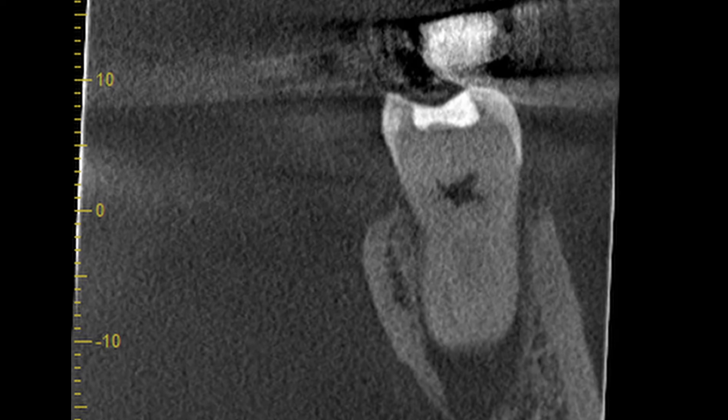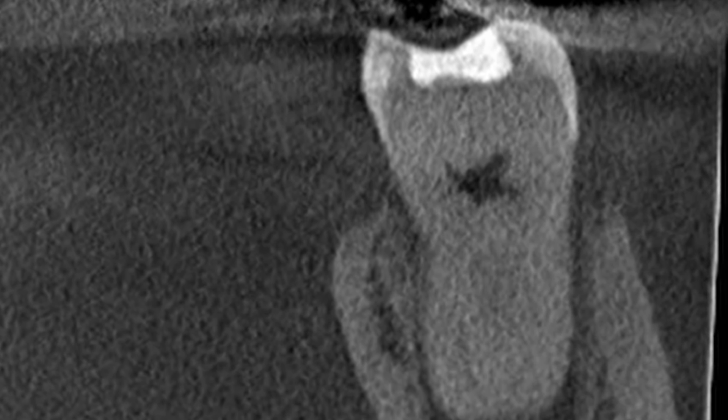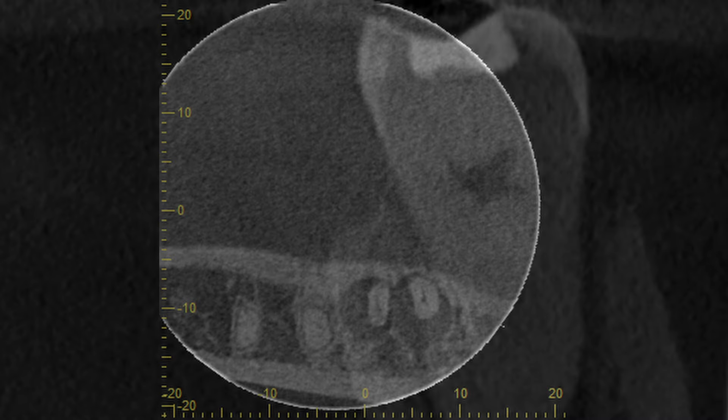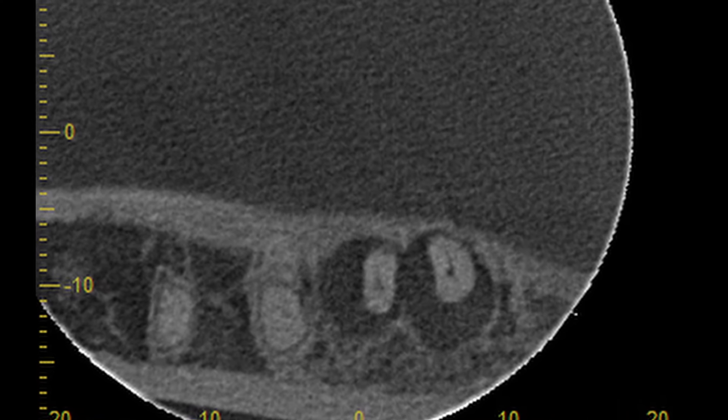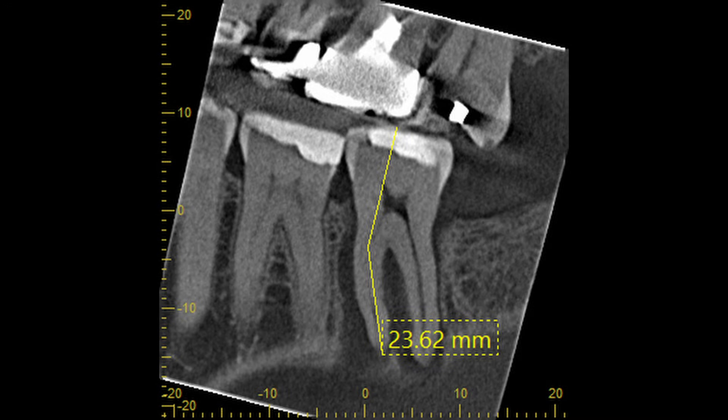On the coronal view, you can actually see the fracture in the occlusal area. And on the axial view, it looks possibly that distal root, maybe that's fractured or if that's just an artifact. Long root, they had long roots.